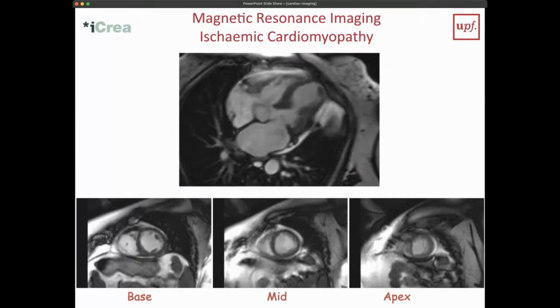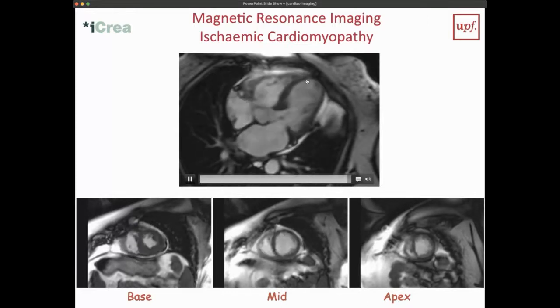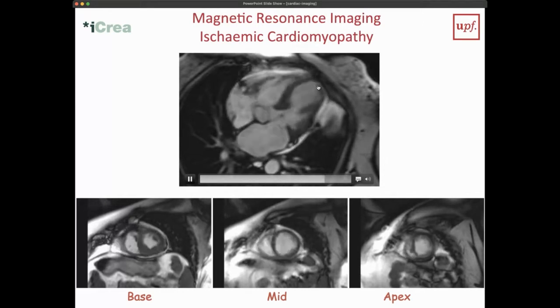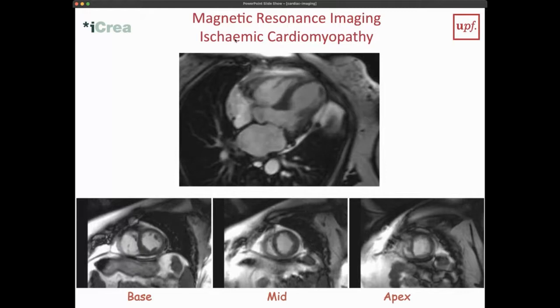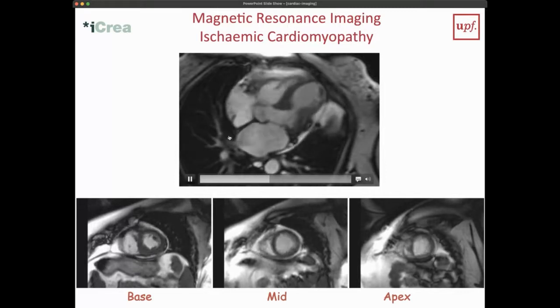Here's an example of an infarct patient. So what you now see is that around the apical wall, the wall becomes very thin and is actually not contracting at all. And you also see this kind of wiggling of the heart inside the sac. So you see here, the outside boundary is not changing. And you also see that this white is actually liquid around the heart, between the heart and the pericardial sac. And here there's a little more liquid than normal.